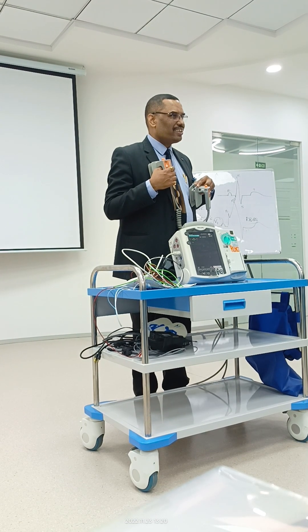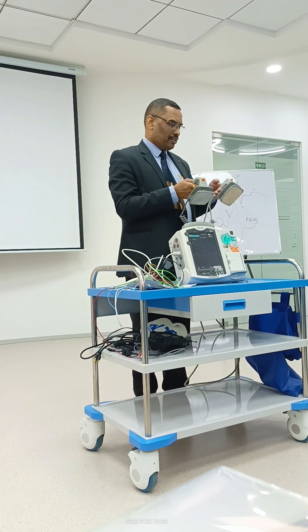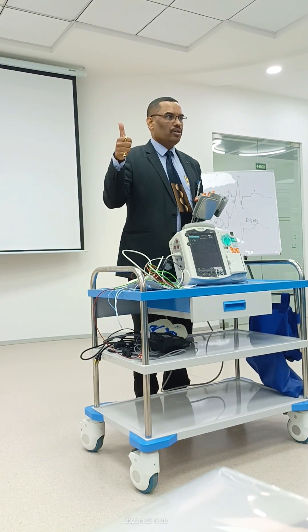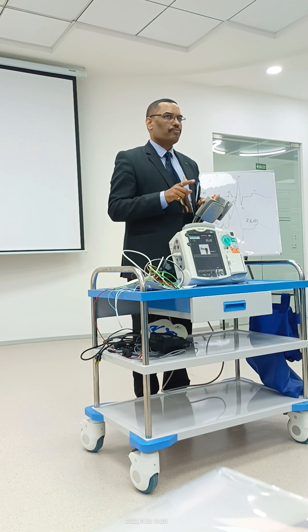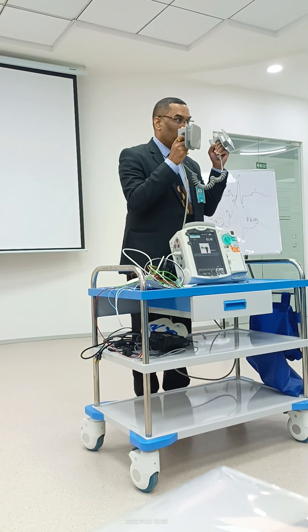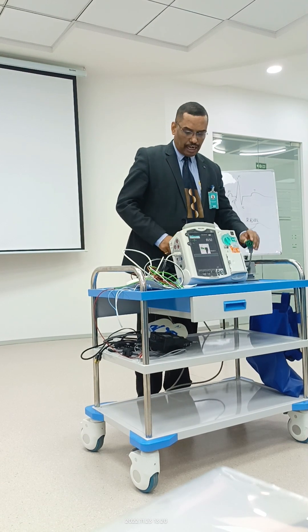Never do this on a conscious patient. Now the steps for AED — yesterday what we saw was: power up. If I go to AED mode, connect the pad cable and it starts giving instructions. A pads cable is required, not the regular paddles cable. So I'm disconnecting this and connecting the black pad cable.